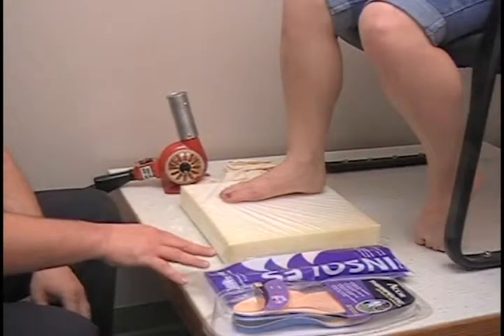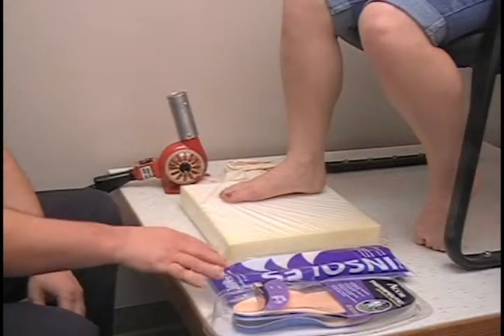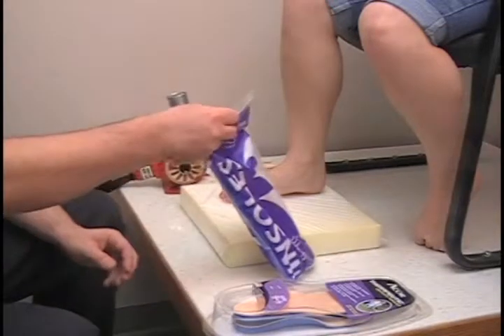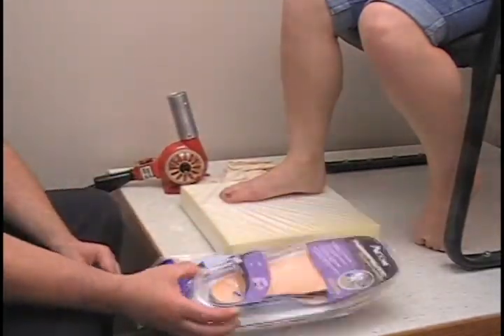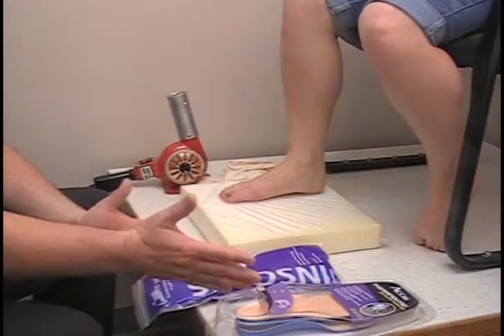For this segment we are going to be heat molding foot orthotics. We are going to do two different types: a diabetic type foot orthosis, and then a more walking type foot orthosis. For this you are going to need your orthotic mold.